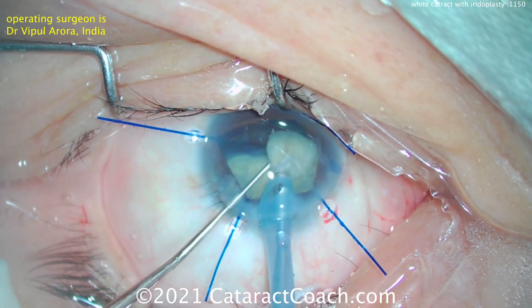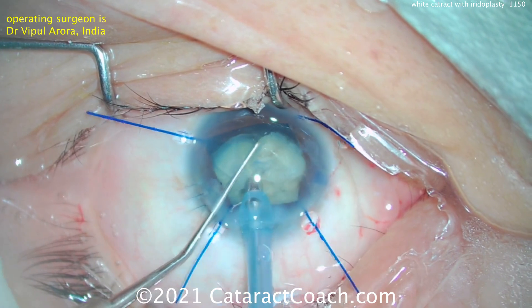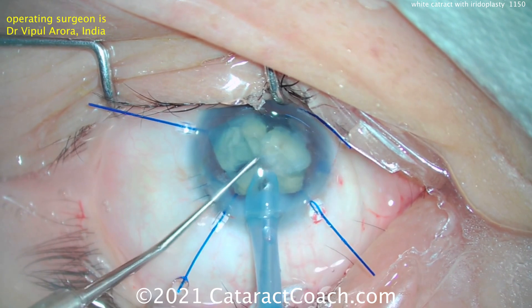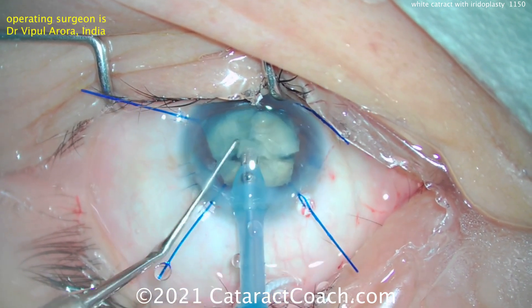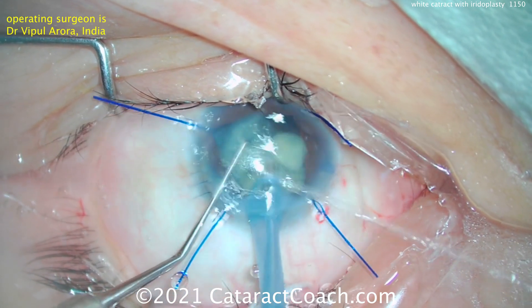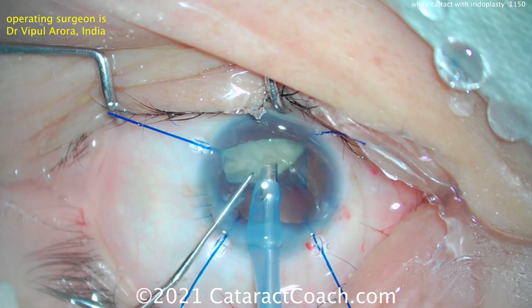Dr. Arora is now having to operate superiorly. The patient has a bit of a brow issue, and therefore it's a little bit hard to access — that's why the eye is slightly infraducted. But taking his time, he's able to get this whole cataract out nice and easy. And then we're going to finish up putting in a lens, and of course the last step is going to be the iridoplasty.